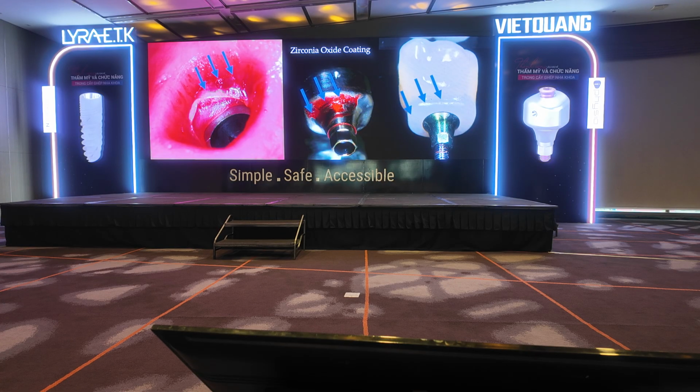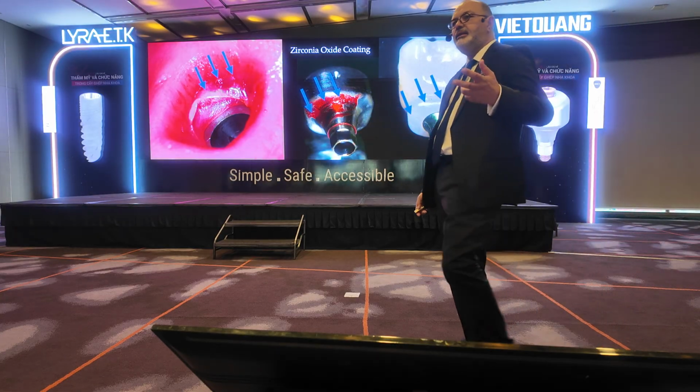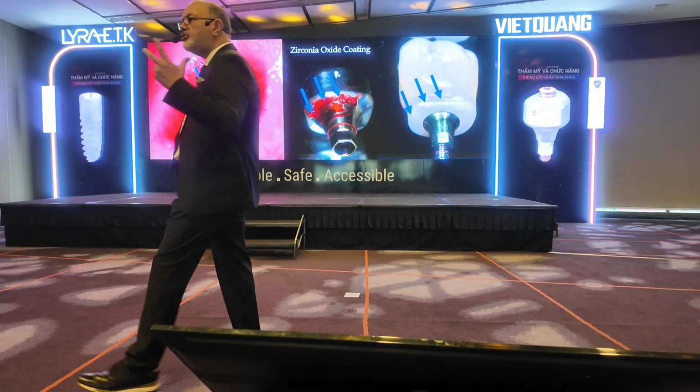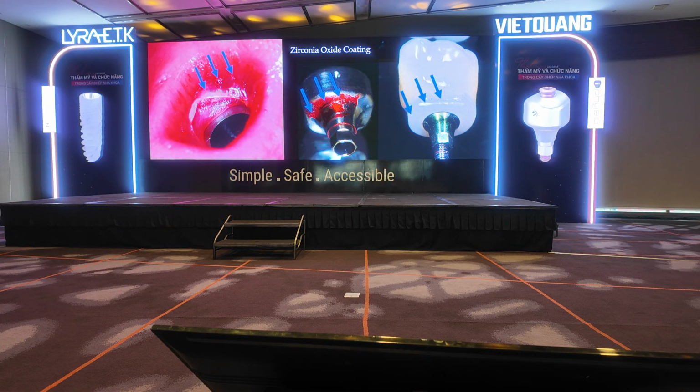The first cases I had, when I see this kind of very red tissue, most of the time when I remove the iphysio, it starts to bleed. I said, I have an inflammation. This is the first reaction I had. I don't like it, because I was used to seeing this very beautiful white keratinized tissue inside. But this is something where the bacteria will jump on it and go straight to the bone.